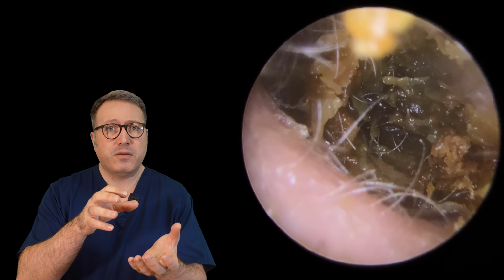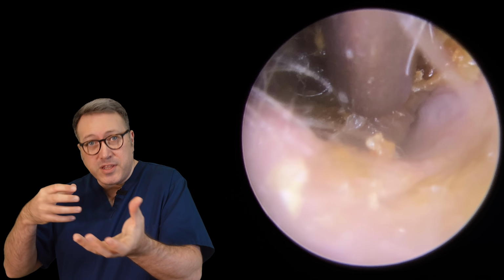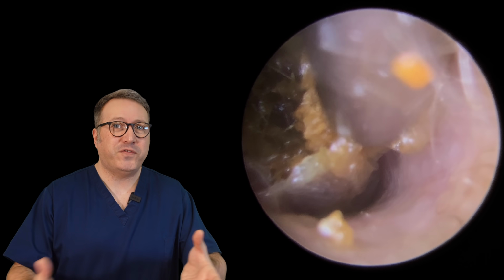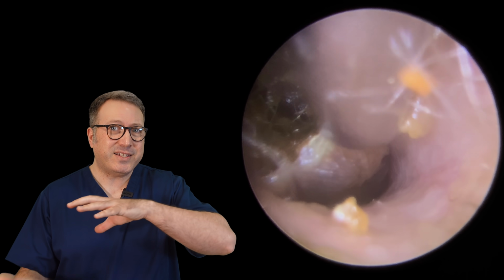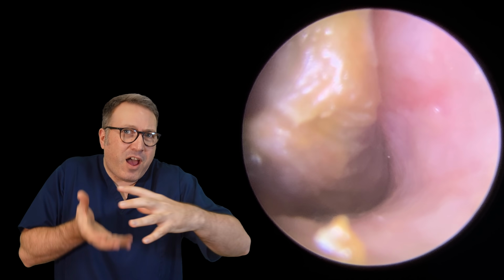So we're just pulling this down. You can actually see a little bit of that dry skin when we pull out of the ear canal, just at the top here. So what I'm trying to do now is lift from the canal walls and see if we can turn this. We're trying to kind of draw it across and lift it up from the bottom.